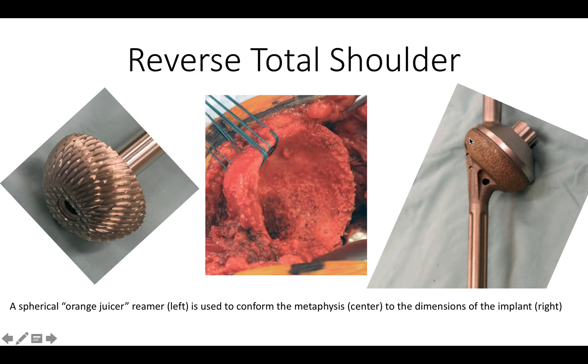This prosthesis has a bone ingrowth surface that nicely fits inside this reamed cup and allows for bone to grow into it.